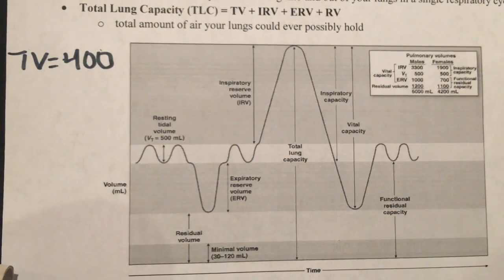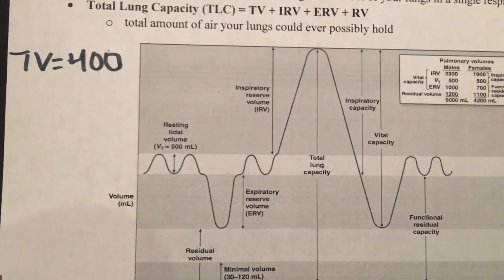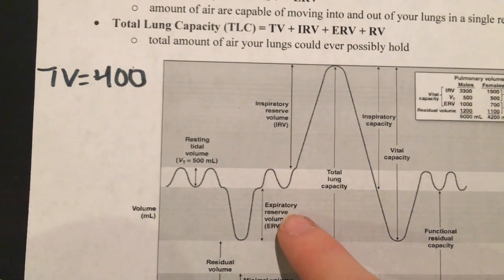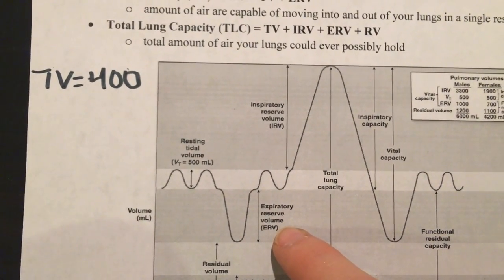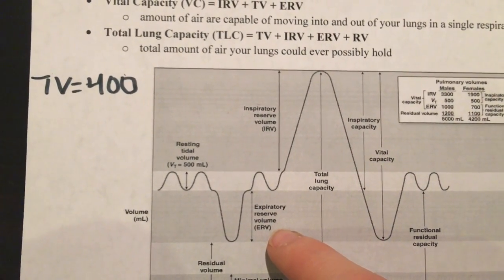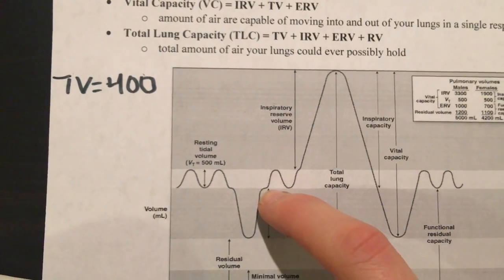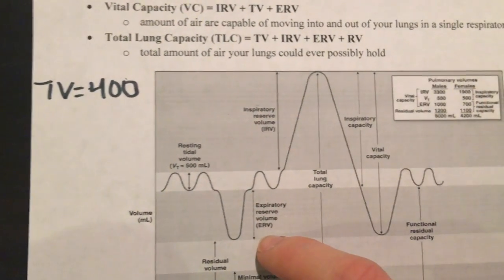The next volume that we can measure using our spirometer, where we're only allowed to do exhaling, is the expiratory reserve volume, or ERV. I can do that by taking in a regular breath, breathing out a regular breath, getting to the bottom of my tidal volume, and then exhaling forcefully to get the ERV.